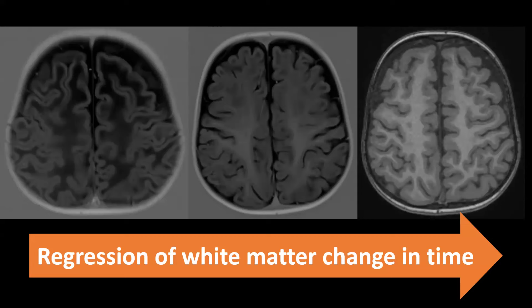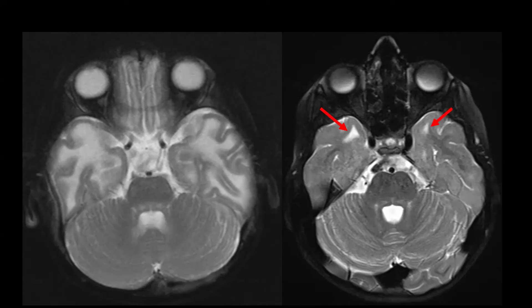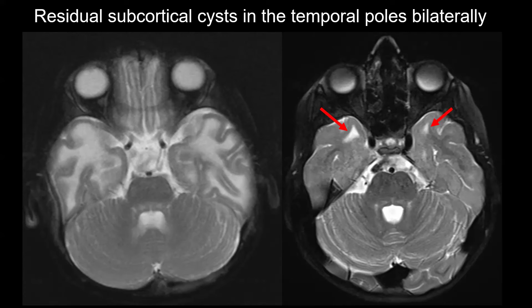The disease is called megalencephalic leukoencephalopathy with subcortical cysts — we have megalencephaly, leukoencephalopathy, and we haven't seen the subcortical cysts yet. These can often be seen especially in the temporal poles, but also in the frontal and parietal lobes. They may not be visible when there are diffuse white matter abnormalities masking them, but on one of the follow-up MRIs we can see signal abnormalities in the typical location of the cysts in this disease entity.